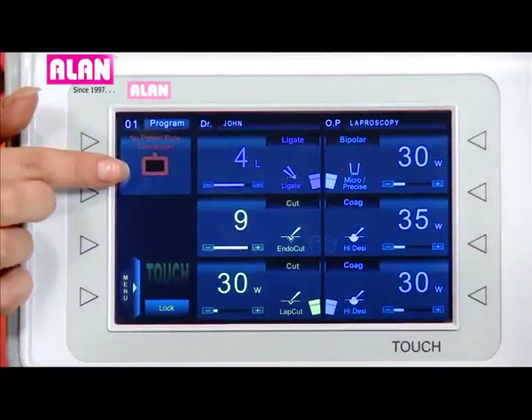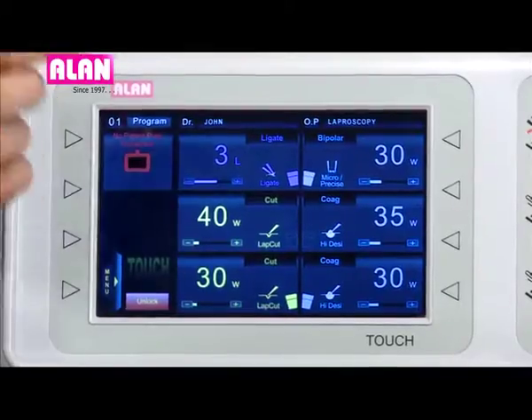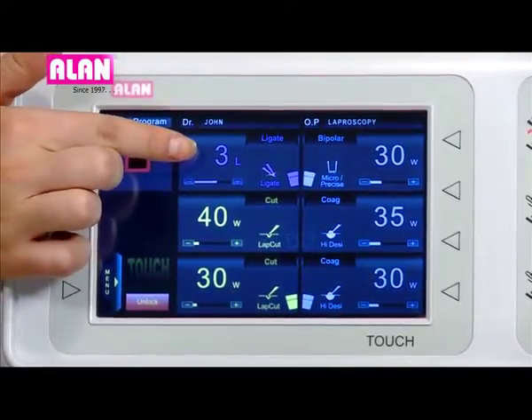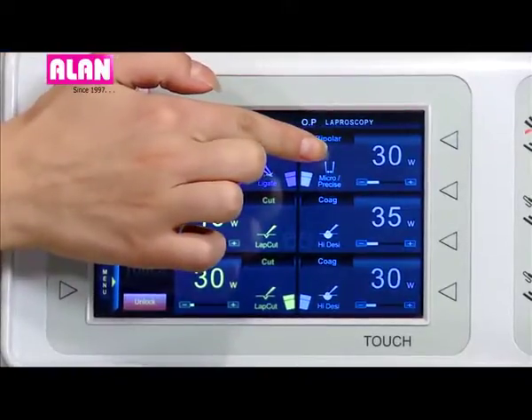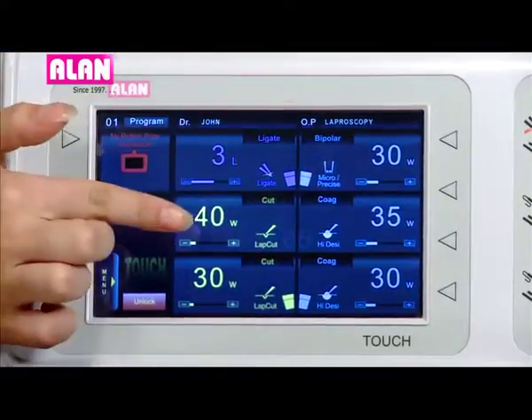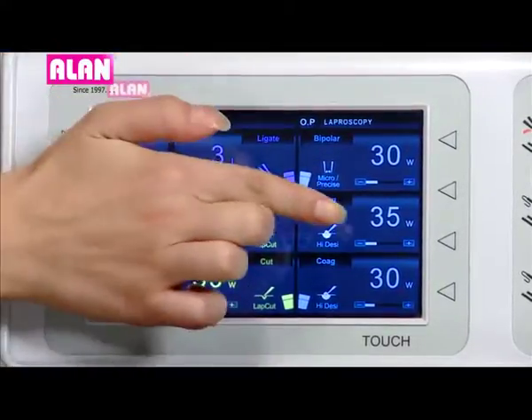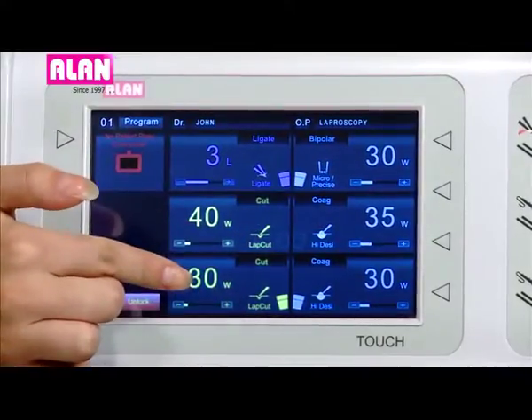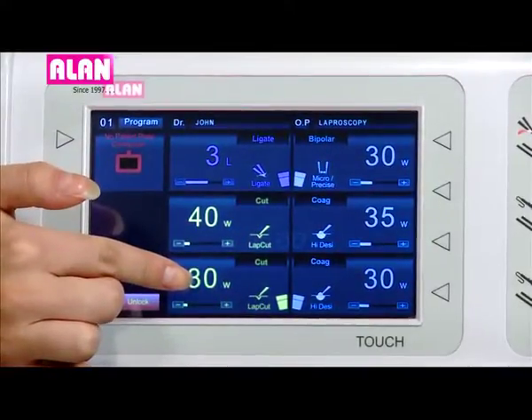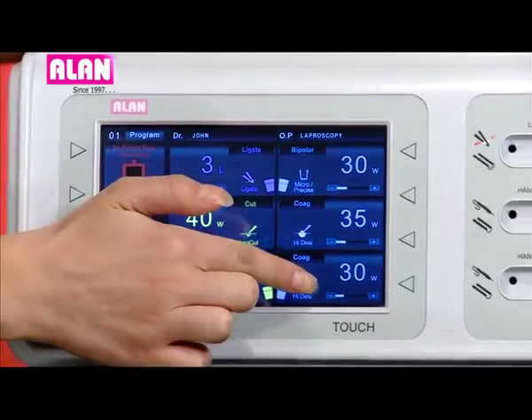The patient plate window shows the type and status of the connected patient plate. The available output windows are: ligate, bipolar, monopolar cut 2, monopolar coag 2, monopolar cut 1, and monopolar coag 1.